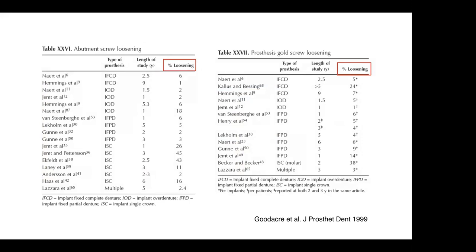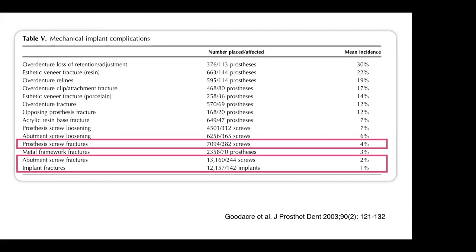Yes, the screw loosening does occur, and it's quite frequent based on these numerous studies. Dr. Goodacre published a real nice review article in 1999 and also 2003.